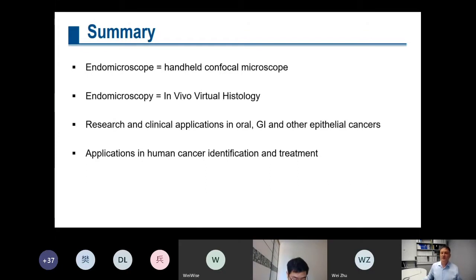This may evolve into clinical procedures for long-term monitoring of oral potentially dysplastic and cancerous lesions, as well as assisting surgeons in mapping the edges of epithelial cancers in the mouth prior to or during surgery.